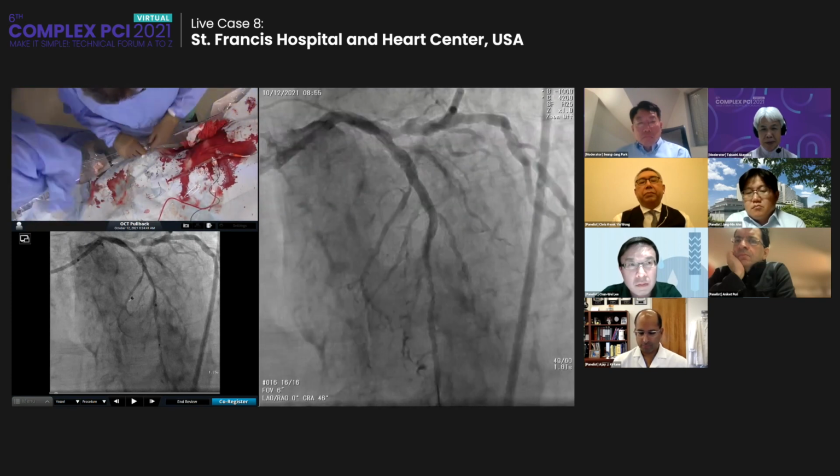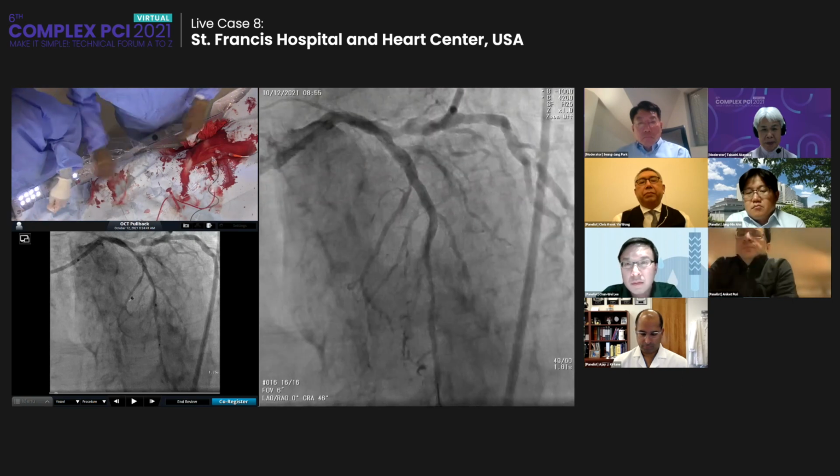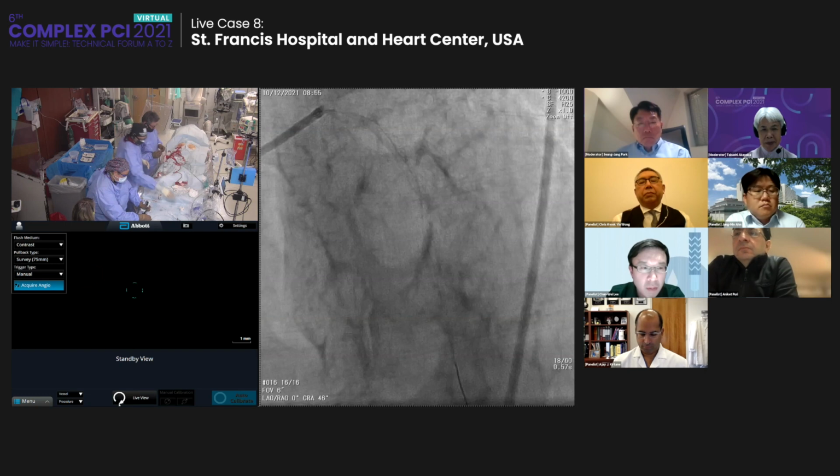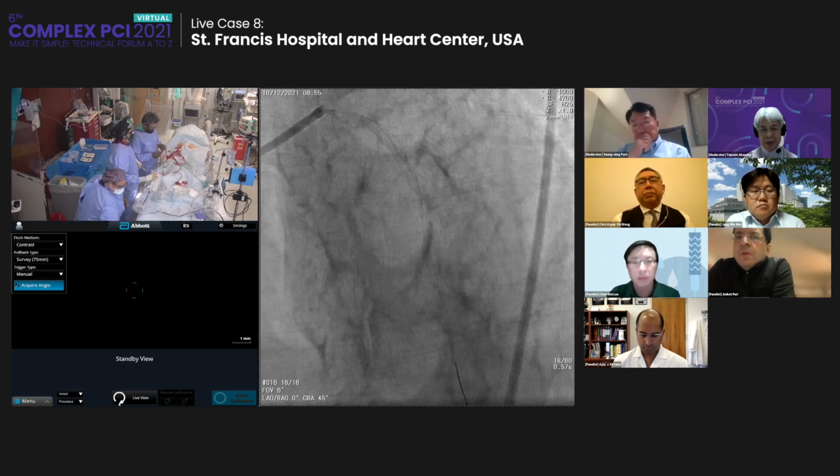So I think our stent looks great. There's a little question at the distal edge of what's going on. It could be a step up, step down, but there's one way to know for sure, and we're going to do it. But you see, we don't take a lot of puffs in between. So really the OCT guides the procedure for us.